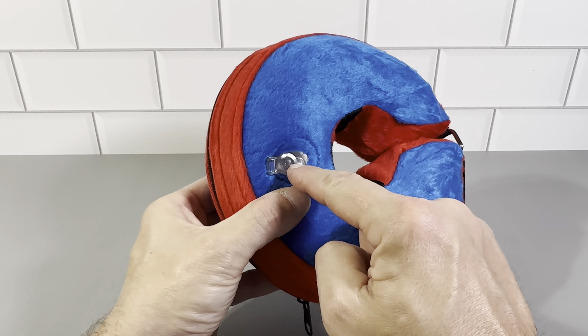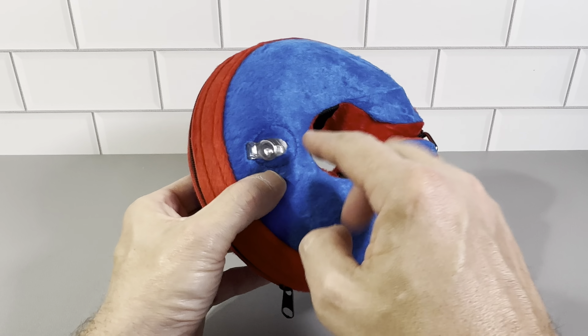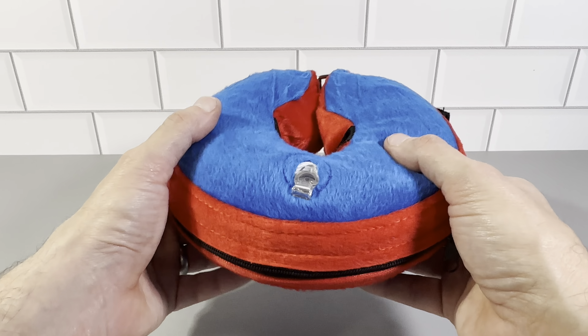It's got the hole right here where you can get the air inside. You could just blow into it or use a pump, but it does not take a lot of air — it fills up very, very quickly.